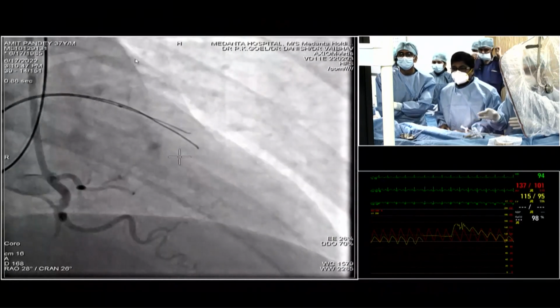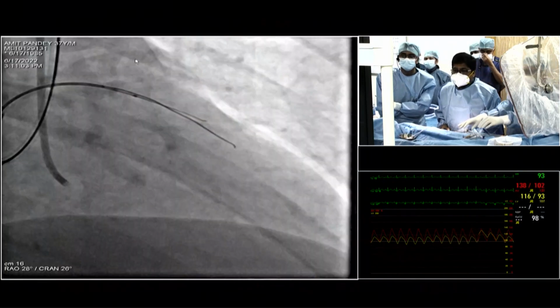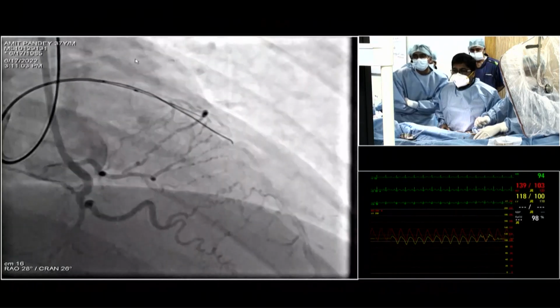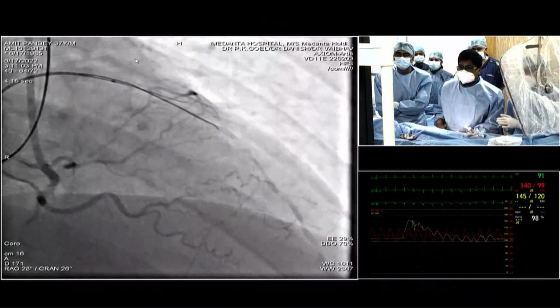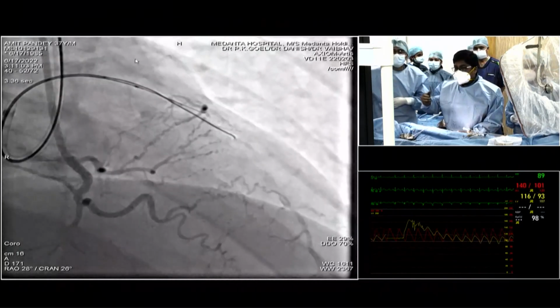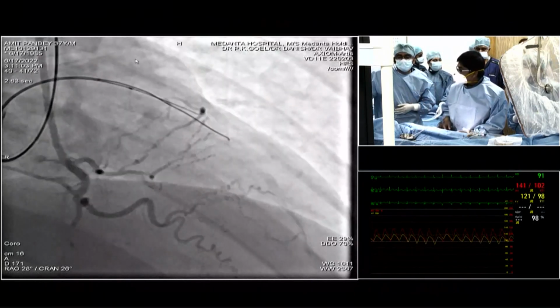I don't know, it should move faster, no? Yeah. Right, come on. No, it is in, I think. It is in. Huh? What do you say? So all these collaterals get lost when dissections happen, and that's the importance of always having a contralateral injection.